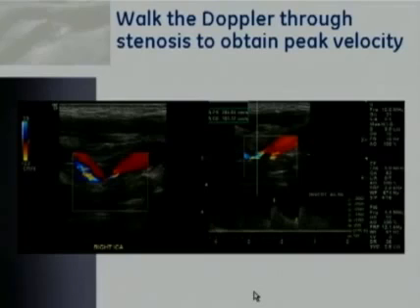This helps me a lot because if I'm looking at a residual lumen that has a diameter of only 1 millimeter in a breathing patient with cardiac pulsatility, and I have a 1 millimeter sample volume, I can't keep those locations matched in real time, and I'll just get pieces of the stenosis, and it will be very hard for me to get a good Doppler signal.